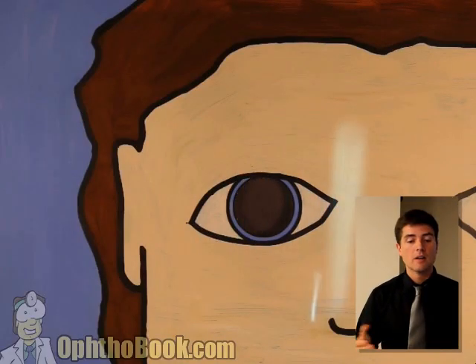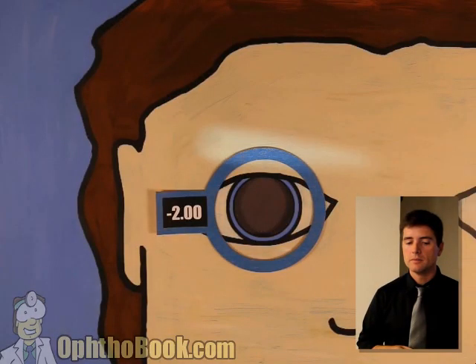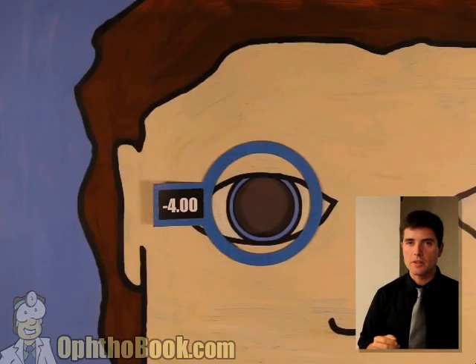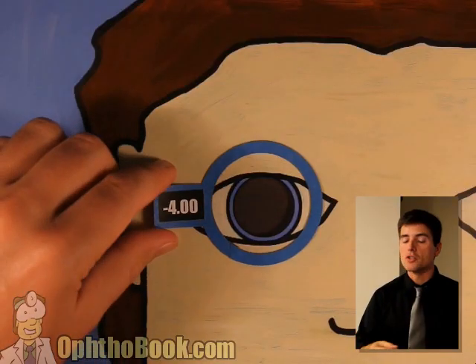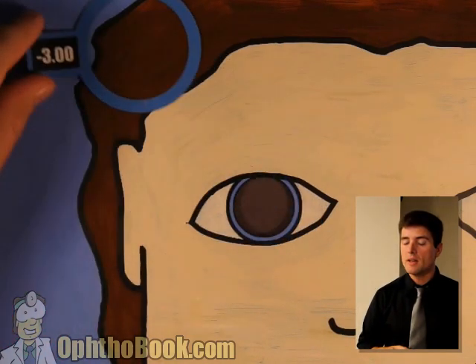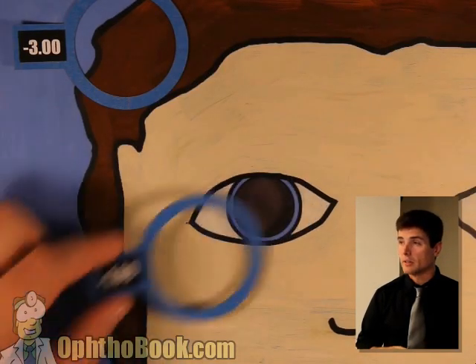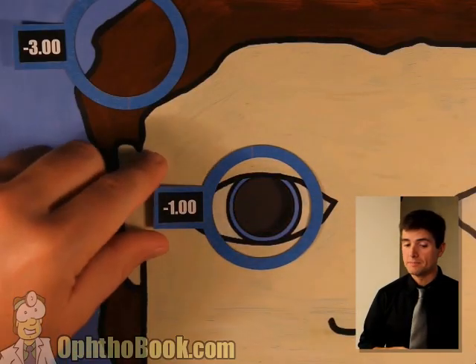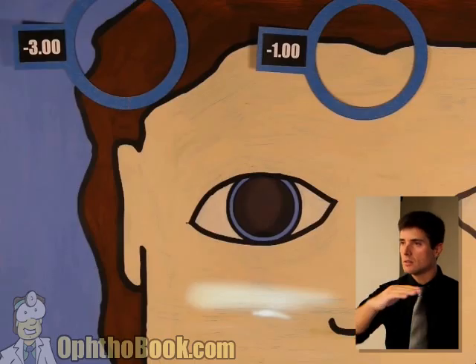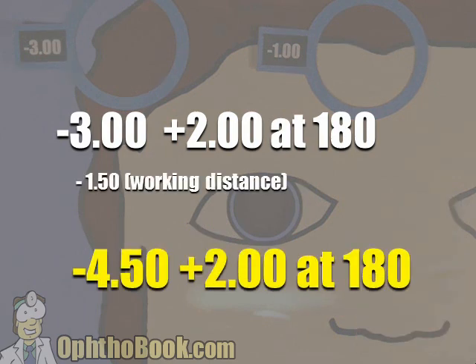We're going to do this one more time. We have against motion — you can't start with against, you've got to have with. Let's throw a minus four. All right — we definitely have with. Let's try the other axis — make sure it's still good. Now we have with in all meridians. We can continue with step two: add power to neutralize the reflex. Try a minus three — we've got it this direction. Set this lens aside before we get confused. Continue adding power for the other direction. Try minus two — not quite there yet, getting closer. Let's try minus one. I think we've got it. Set it aside, then write things down. This is a minus three plus two — that's the difference. Axis is at 180. Write that down: minus three plus two at 180. Only then do you subtract your working distance from the sphere power. Final answer: minus 4.50 plus two at 180.